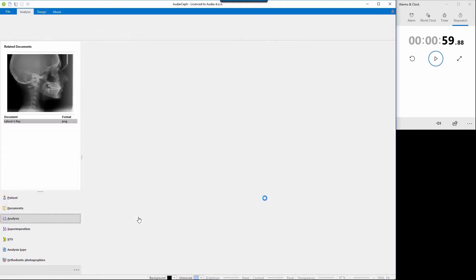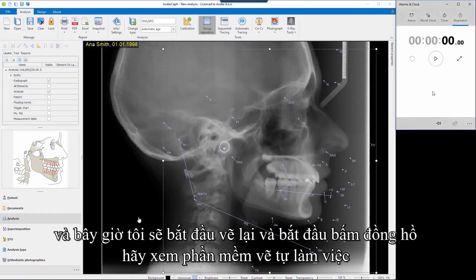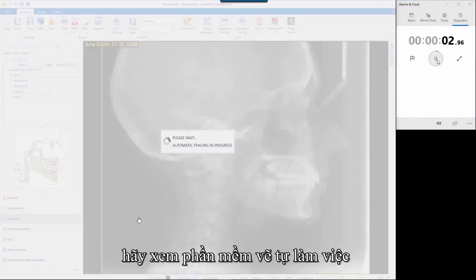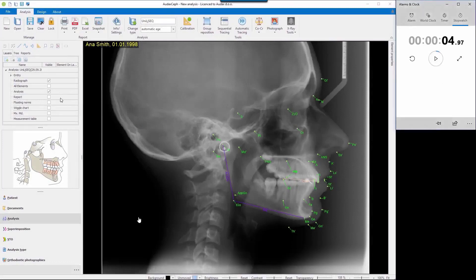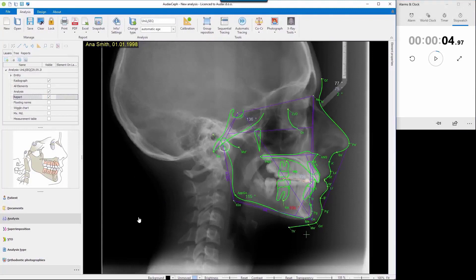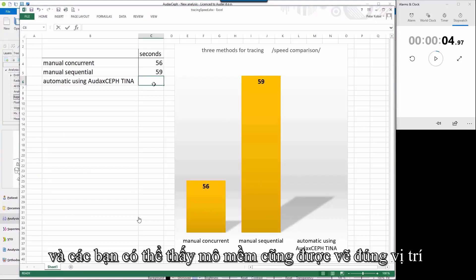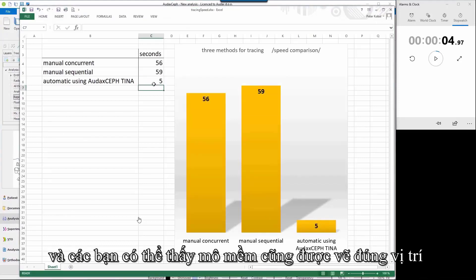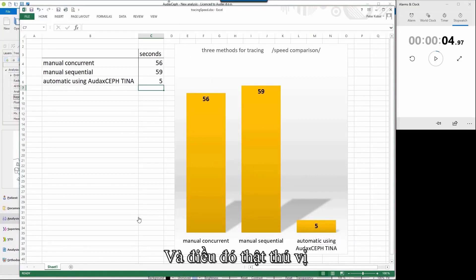I'll again start with an image and start the stopwatch. Automatic tracing — the software is doing something and all those points are traced automatically. Just five seconds only, and you can see that soft tissue is also traced correctly. It's very amazing, very effective. So, who wants to trace manually if there is an automatic tracing tool?